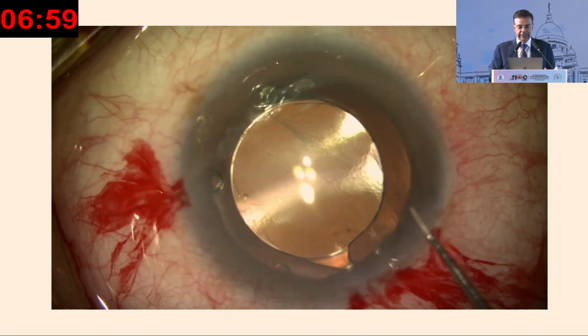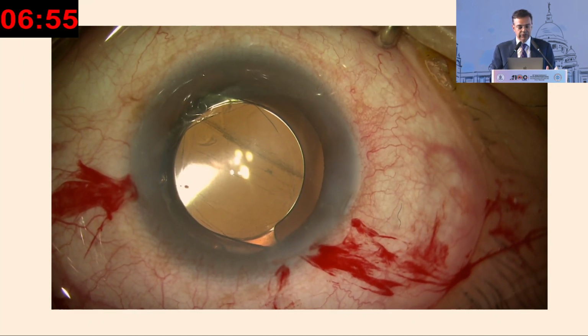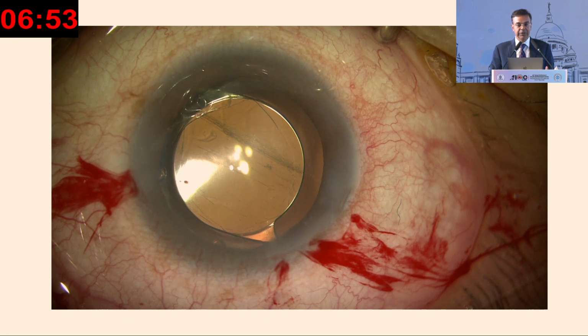Otherwise it's not very easy to do an optic capture because they are posteriorly angulated lenses. So it's difficult to do an anterior optic capture, but here the fibrosed rhexis was able to hold it nicely. The patient did well. There was very little intervention. She had been told by several surgeons that she would need an IOL explantation, a glued IOL, and refixation and all that.